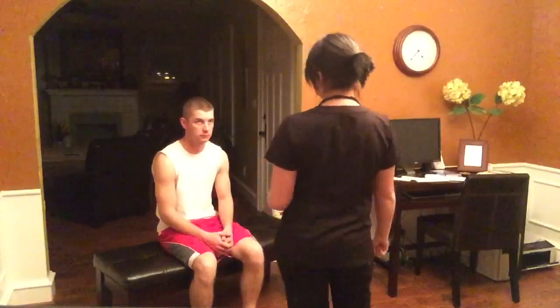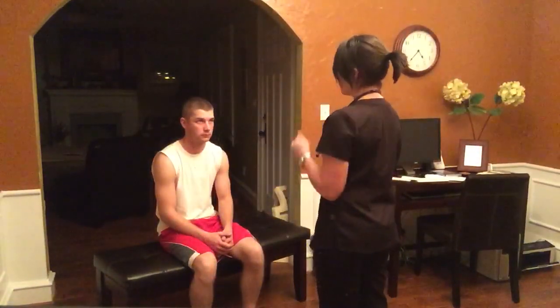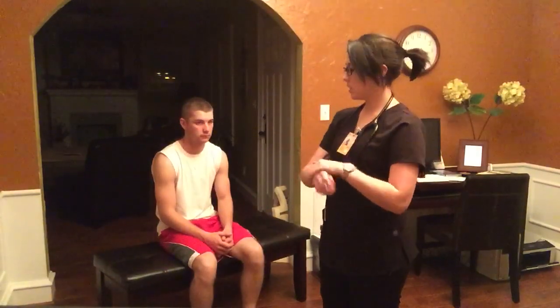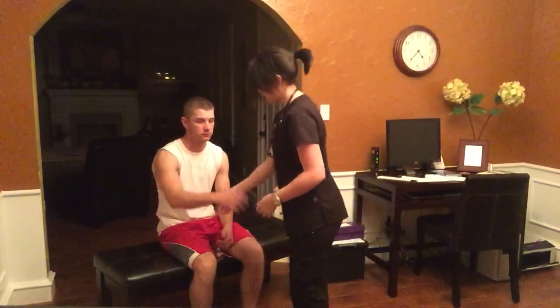Name's Amber and I'm going to be your student nurse. I'm going to do a head-to-toe assessment on you, but first, before we begin, let me wash my hands. Alright, can you tell me your name and date of birth?